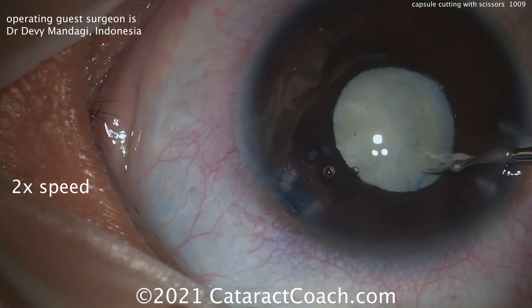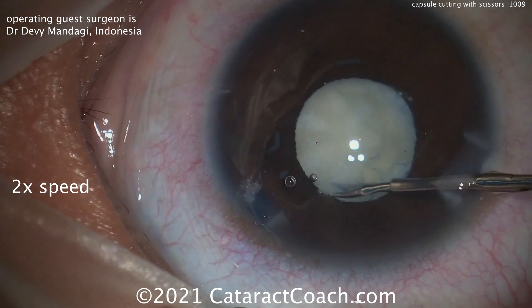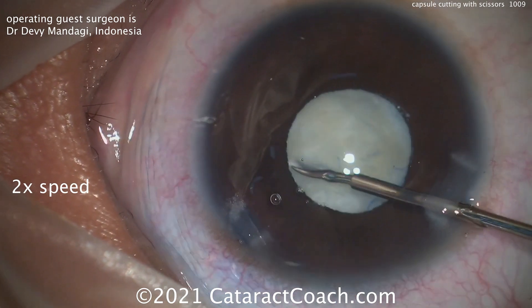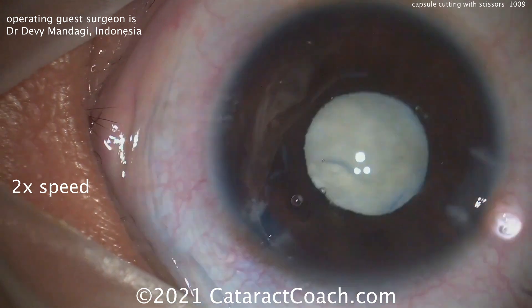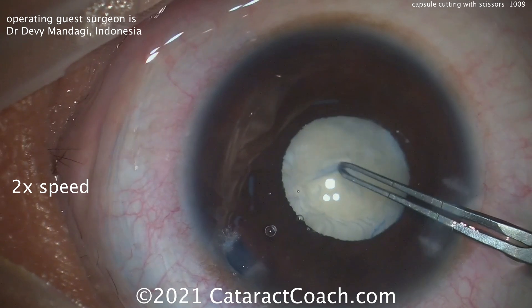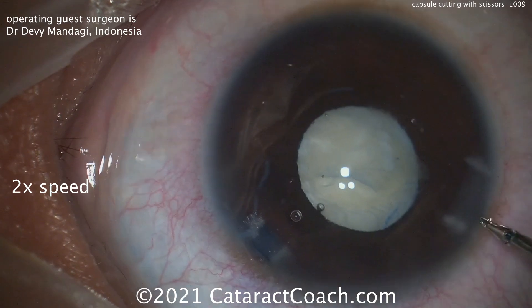This is sometimes seen in white cataracts where the patients have had the white cataracts for a very long time. The lens material — the lens cortex — which was initially liquefied and opacified, becomes absorbed. The lens capsule contracts, and you can see you just can't possibly tear it.